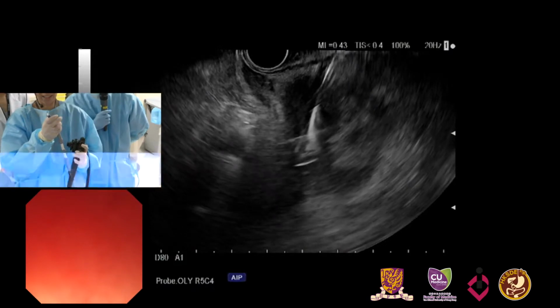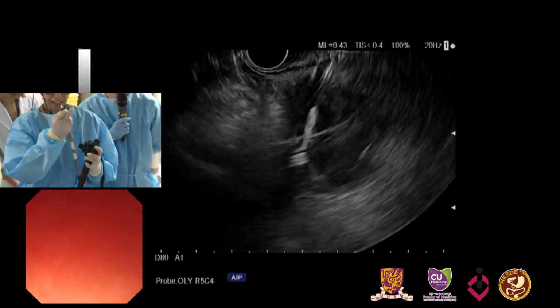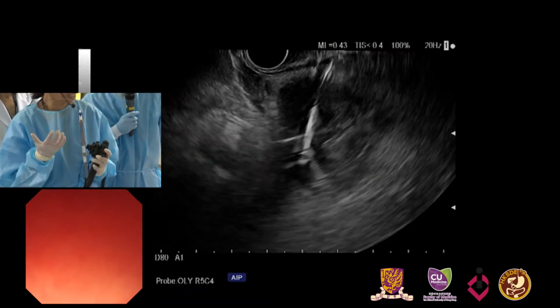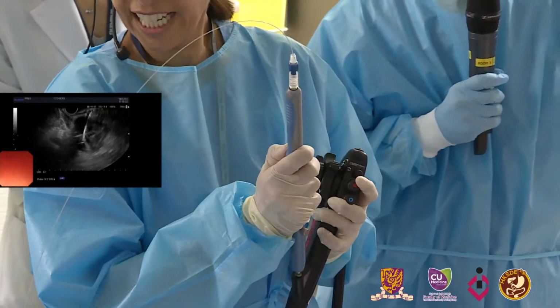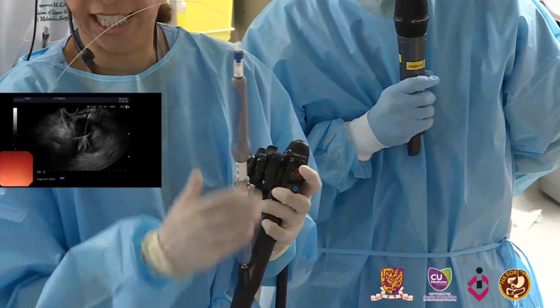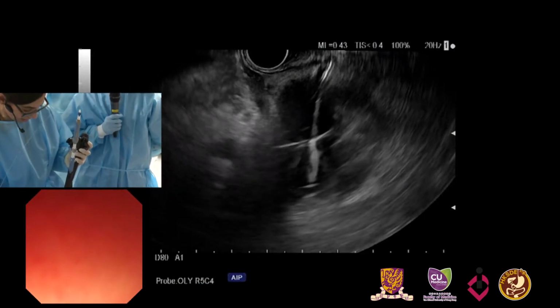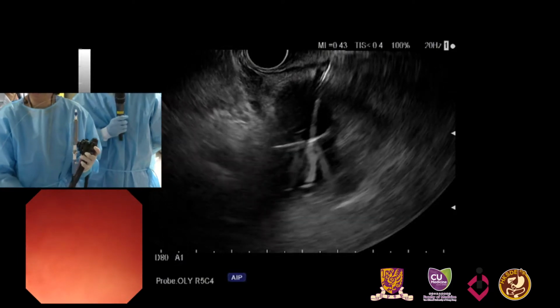So the issue here, whenever you're doing confocal imaging in a pancreatic cyst, as everyone knows, is that histologically these cysts have really varied epithelium if you were to resect the entire specimen. So depending on where your probe hits the cyst wall, you're limited in terms of what views you're going to get, which is why our group has been the lead author on a few studies related to confocal in the pancreas, especially the initial study in the pancreas we published in 2011.